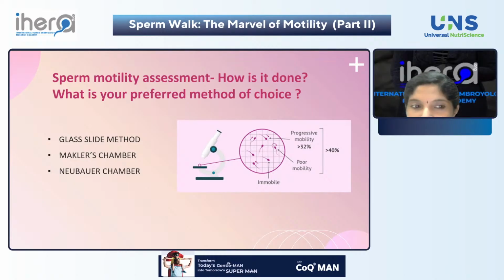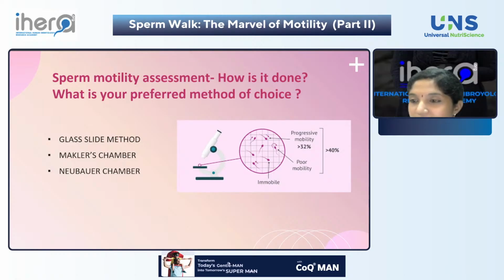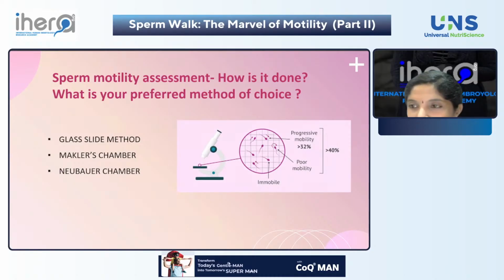Thank you so much. Anybody? Any other panelist differ from this opinion? Yes, sir. We are using the Makler chamber to assess the exact concentration and motility. So my preferred method is the Makler counting chamber. Do you want to elaborate on the method specifically, sir?